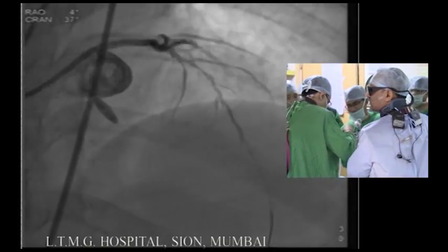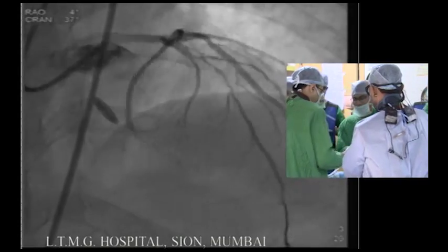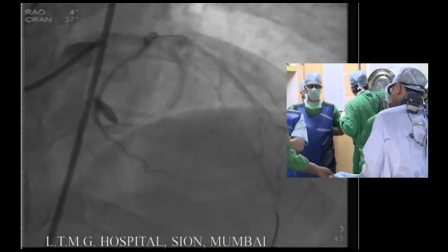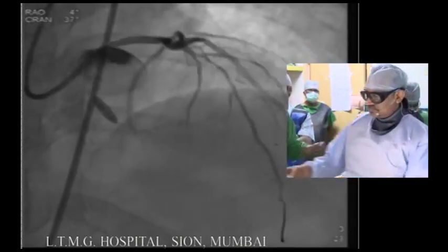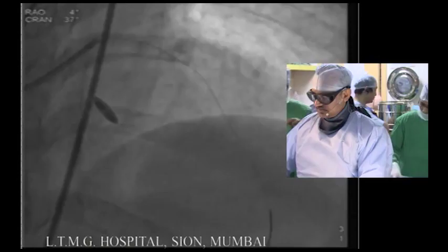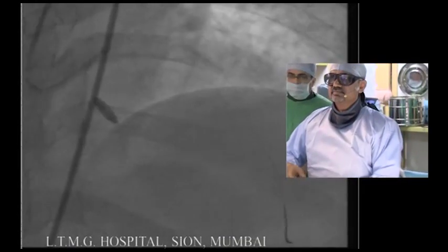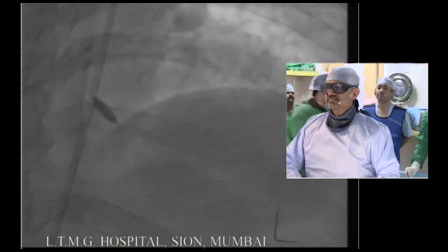I will agree with the guidelines given in the lecture that we can make the difficult case simple. The most important part will be a good catheter for support, and the next thing will be to choose the proper wire. I will choose the extra support wire and then pre-dilate first and then IVUS. Will you pre-dilate first or IVUS? Yeah, pre-dilate.